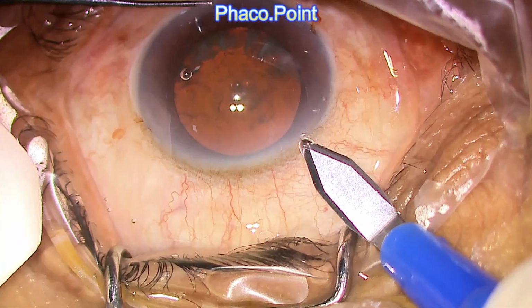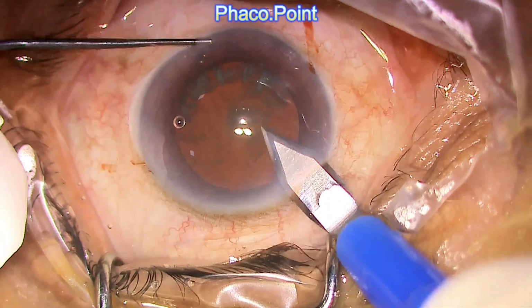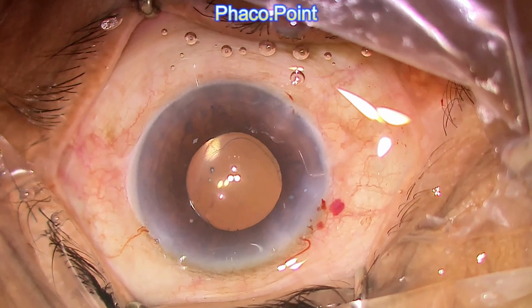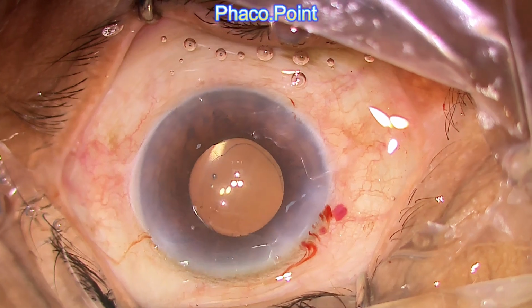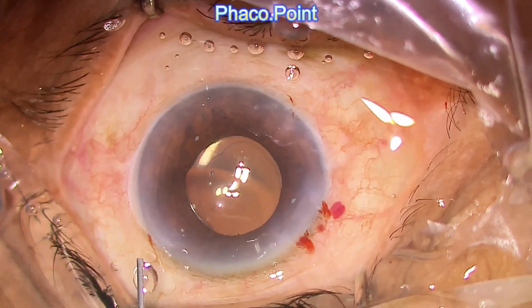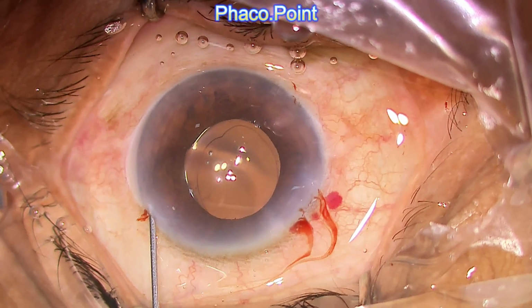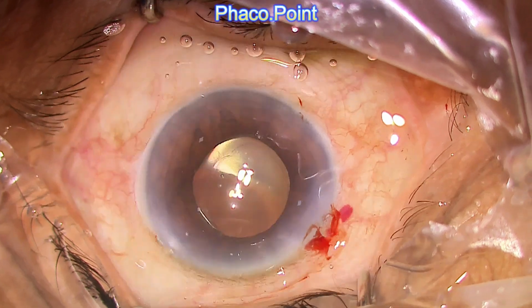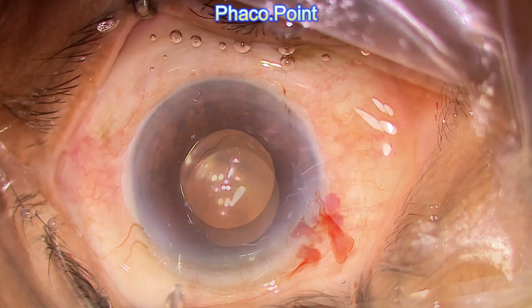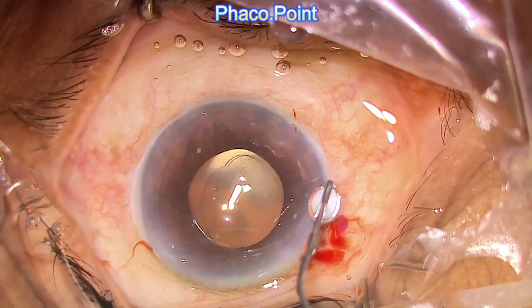Let's take another example. The clear corneal incision is made, and towards the end of the incision, you don't even need to use the cotton bud. All you have to do is just inject very small amounts of balanced salt solution through the side port. And as you inject, you will notice perceptibly there's an increase in the intensity of stromal hydration occurring at the clear corneal incision. The eye has become rock hard in this case. So this is because the fluid that goes inside first seals the valve, and then it causes further stromal hydration to occur.